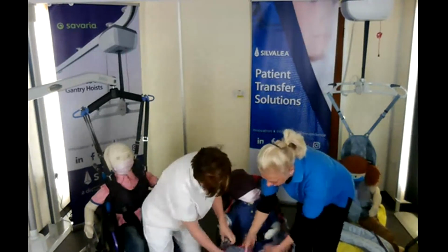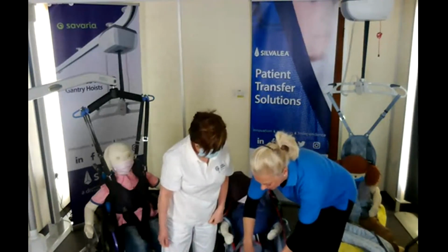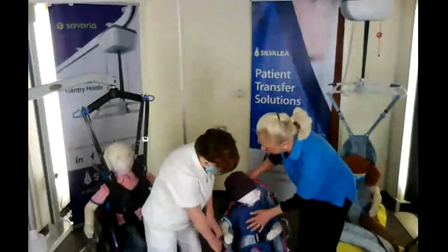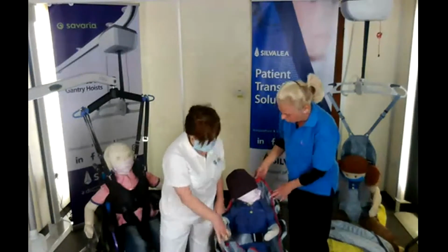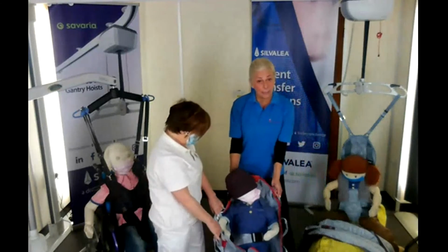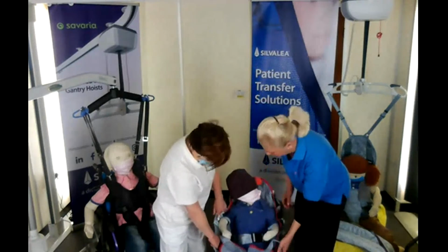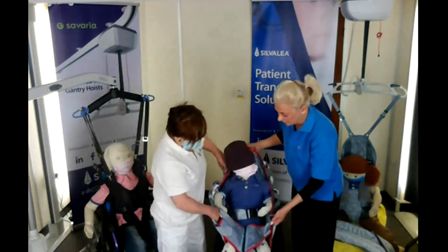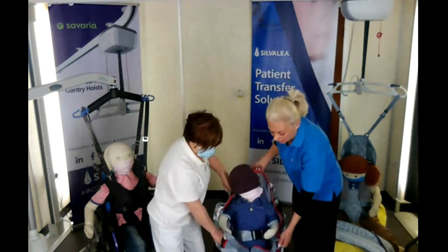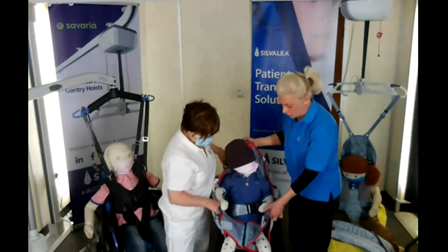And then there's a little zip section. So connect the multi strap and zip the legs together. Got that there. So we've got it on, quite straightforward. And then, as I said, there's positioning handles all the way around. Depending on how many carers you've got, you may have someone holding at the back or at the side. This one, of course, is very light, so I'm going to use those there and just to lift. So then we can get this person to either a changing table or somewhere where you can apply a sling, but very straightforward. Just turn it round.